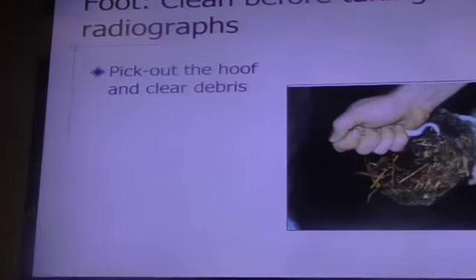So when someone tells me that they understand the obliques, I'm going to say, well, you weren't in class. That's all I'm going to use it for. So I can just bring that into your head. Good, Carson, constructive criticism. So don't forget the shortcuts I gave you. Do those shortcuts.